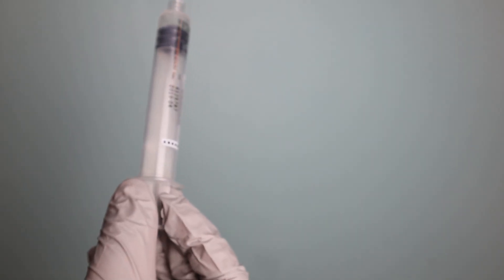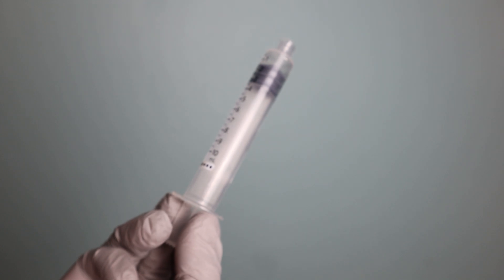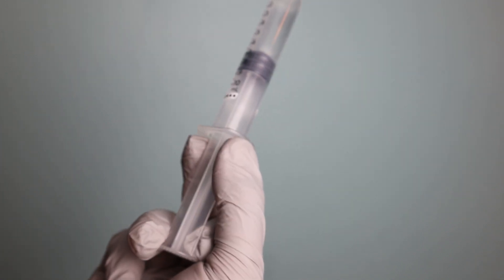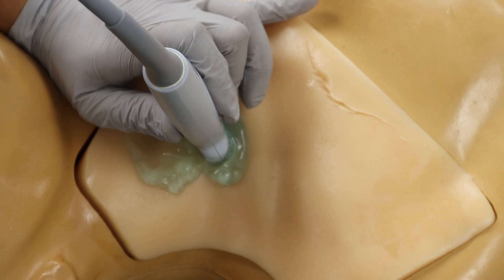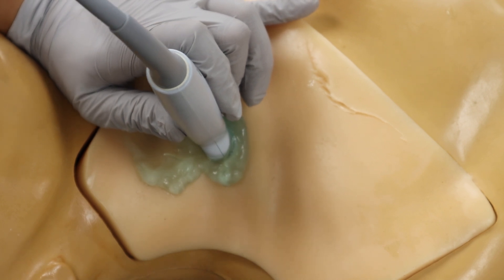How should you hold the syringe? Your index finger and ring finger should curl around the lip of the plunger, while your thumb and middle finger brace against the lip of the syringe body. This allows you to pull the plunger while pushing away the syringe body at the same time. You'll be using the ultrasound probe with only one hand, so brace it by resting either the ulnar edge of the hand or just the pinky on the patient.